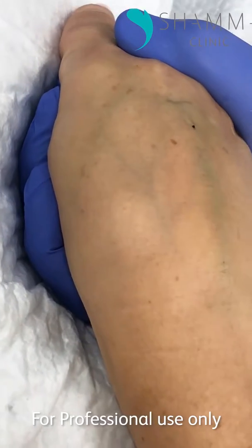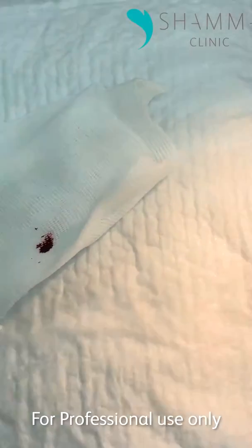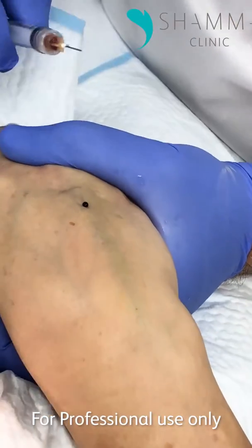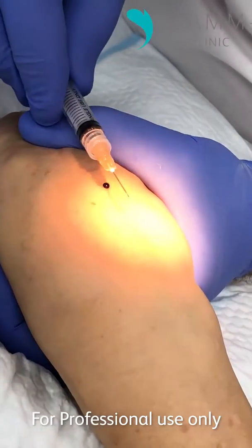And I'll show it to you here. See? It's still coming. Fresh syringe, please. So we'll do it one more time, higher up.